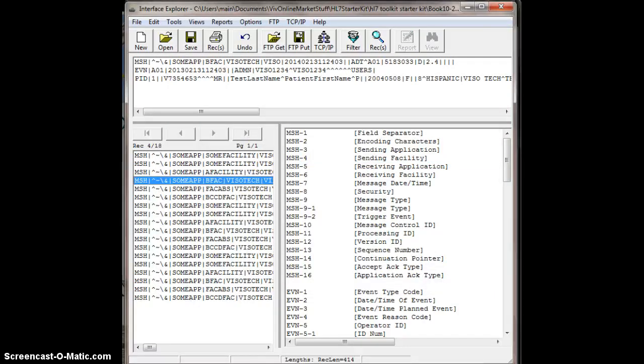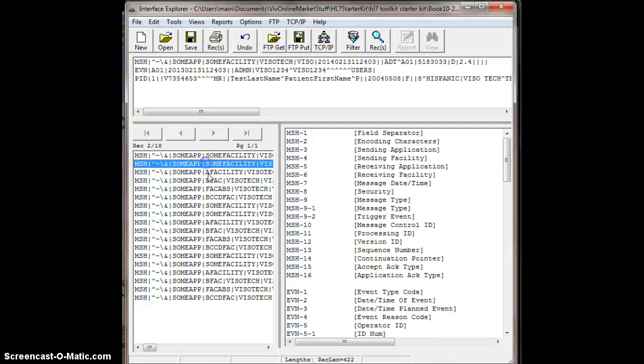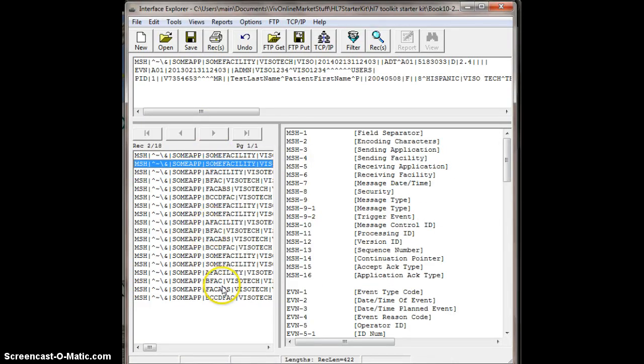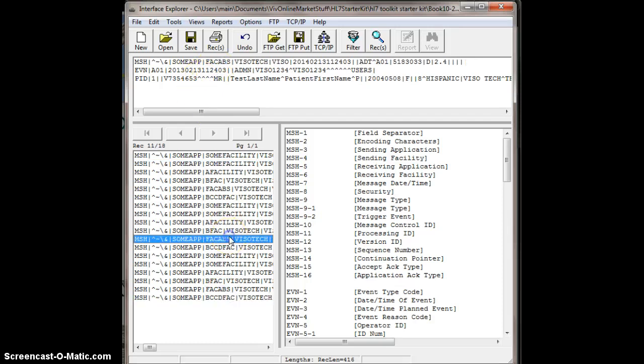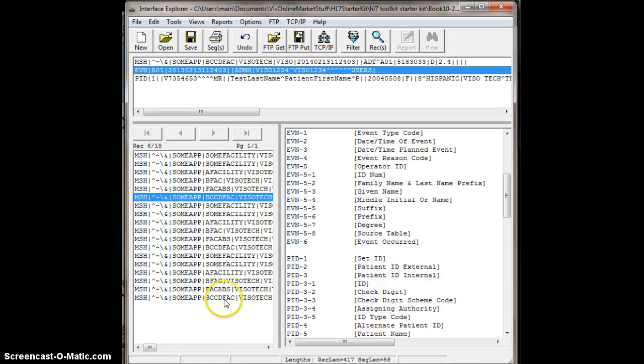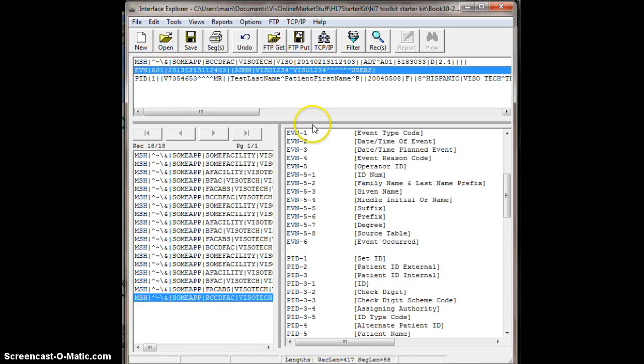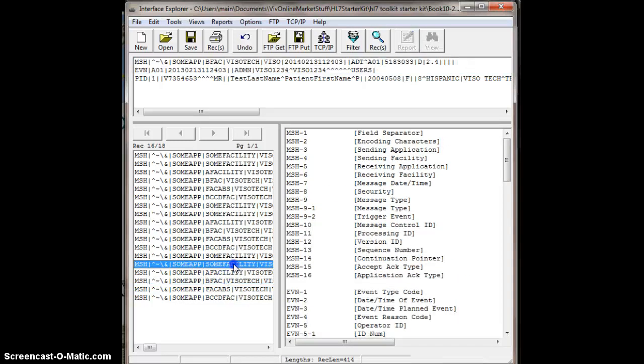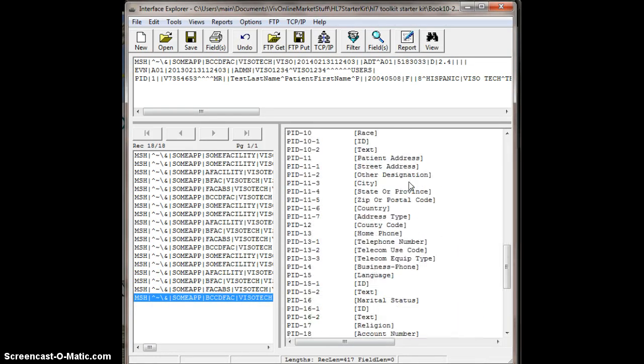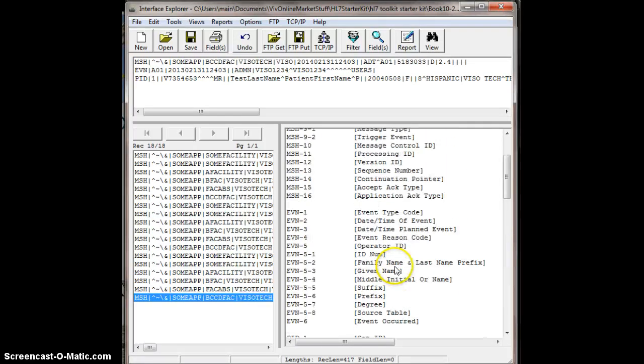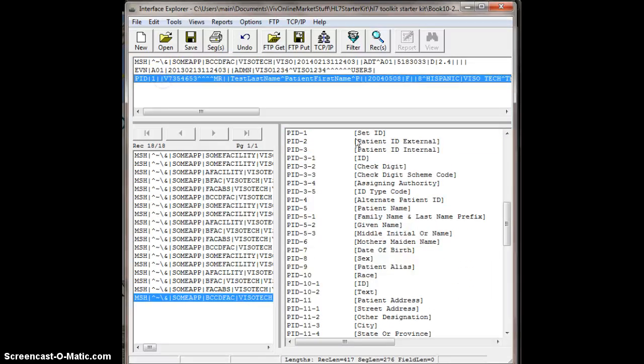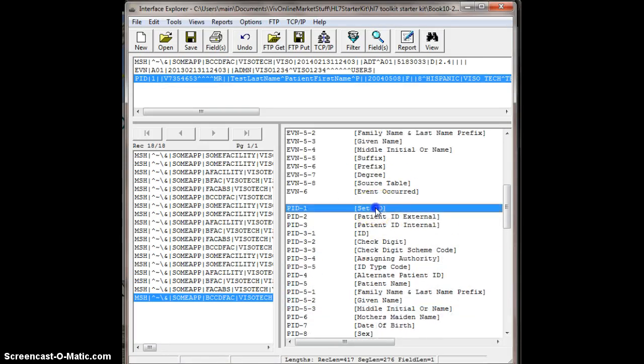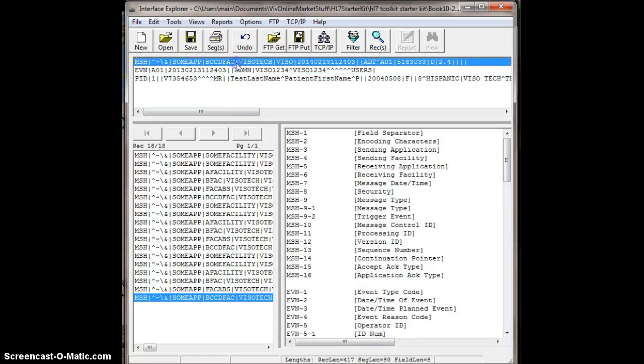And that's it. And I have here the last piece. You can see all values in a message. Yes, of course. As I click through each message, so that's message one, message two, let's go to message 18. You can see that the top changes here, so let's go to message 18, and let's look at EVN 4. There you go. And you just want to scroll to the right here. As you highlight the HL7 message on the left-hand side, the right-hand side populates with the entire message. So if you scroll down, you can see all of the segments. But if I go directly to a segment, Interface Explorer brings it up to the top of the list.